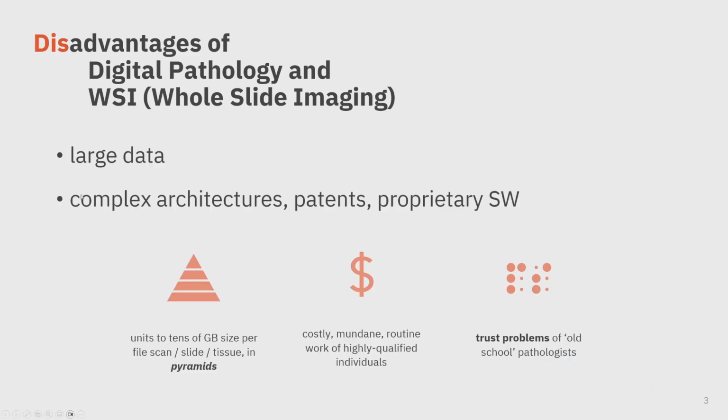However, despite these possibilities, digital pathology is still facing many issues. The data are large and hard to store efficiently, and scans can vary in diverse formats and quality. Files need to be stored in pyramids to allow for efficient viewer navigation. Even today, keeping software architecture supporting digital pathology can be very costly, especially with commercial solutions. Finally, one of the largest issues is the lack of trust from pathologists, who are not used to the role of digital pathology in their field.